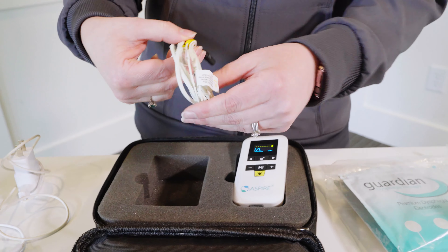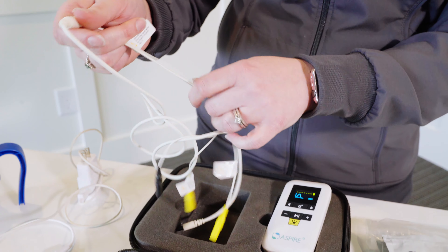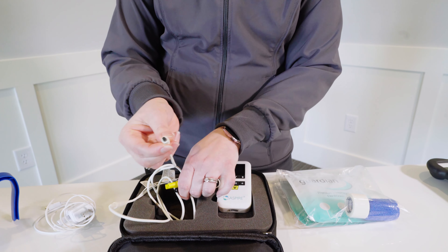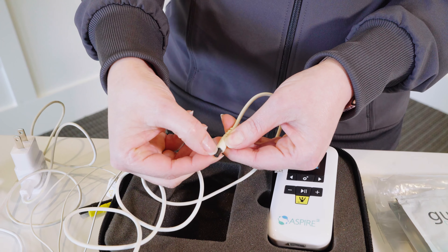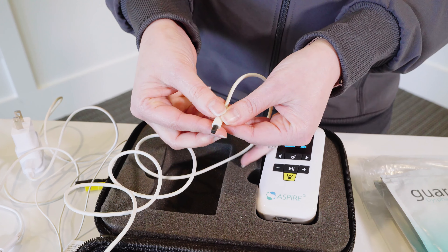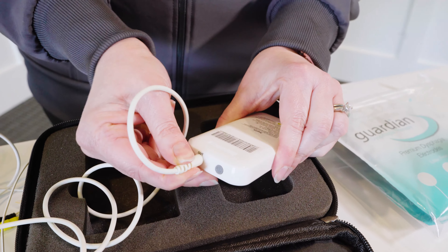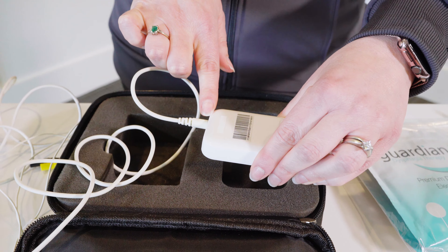Your lead wire is packaged separately and this one lead wire will be used both for surface EMG as well as NMES. The color-coded ends are what go to your electrodes and this is what connects to your device. You'll notice a groove in the black portion with an arrow pointing to it — it's important that you line that up with the word OUT on the top of your device. Gently line that up and insert it until it clicks all the way in.